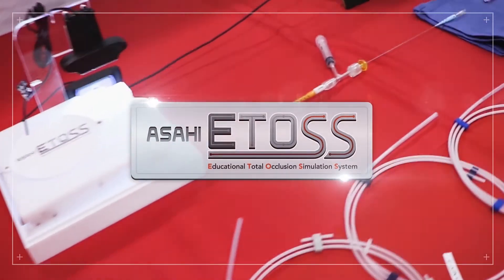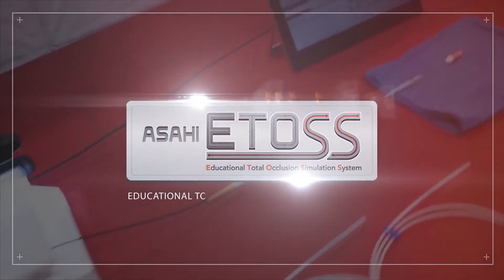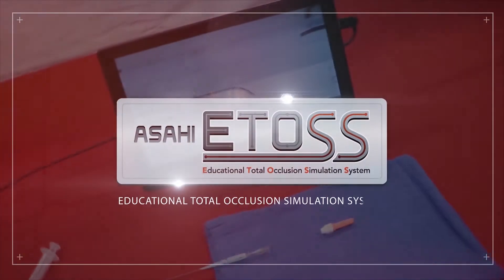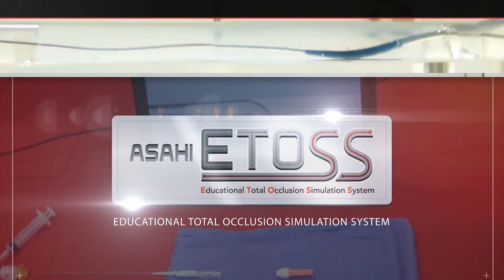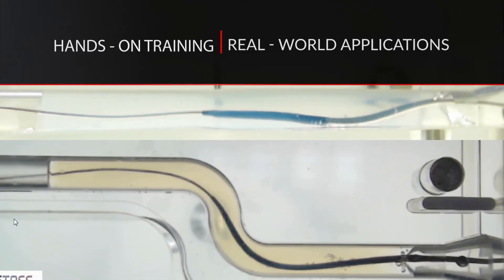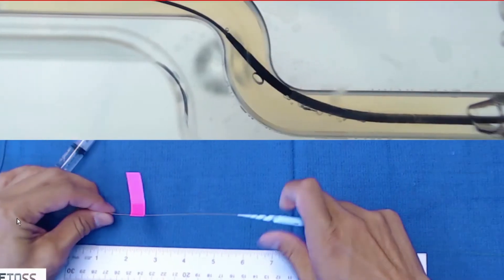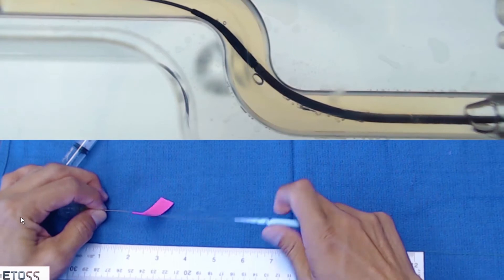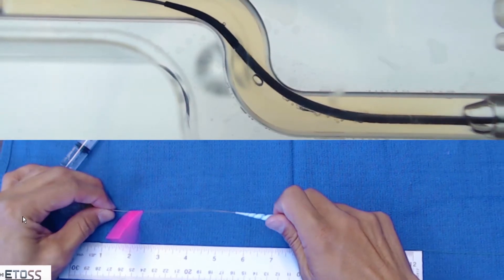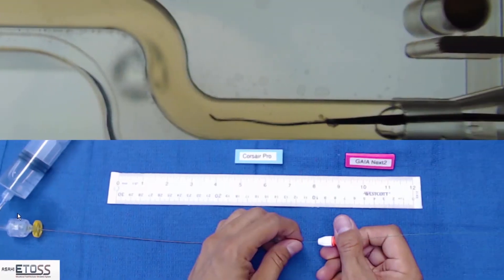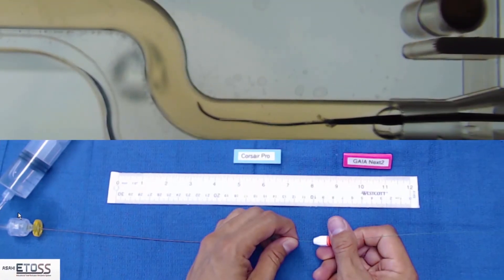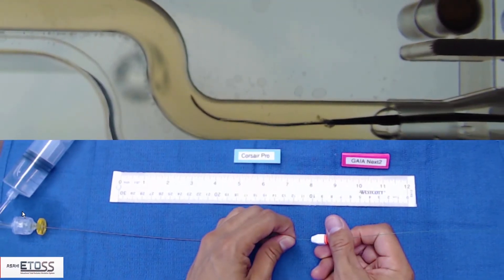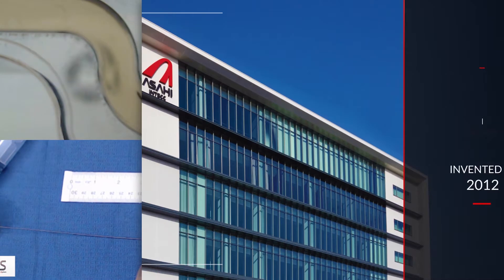eTOS stands for Educational Total Occlusion Simulation System. eTOS can visualize guidewire movements in artificial lesions utilizing Asahi's own line of CTO guidewires and advancing microcatheters, giving doctors the hands-on experience of advancing the products themselves in a controlled environment.